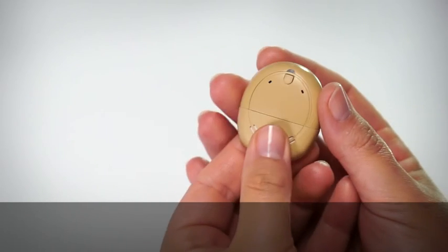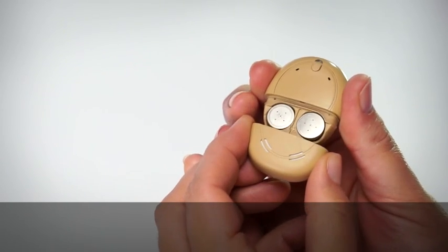To remove the battery cover, use your fingers on the sides to pull the cover off.